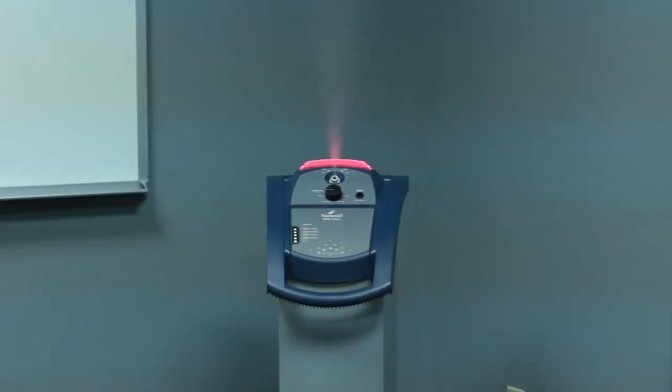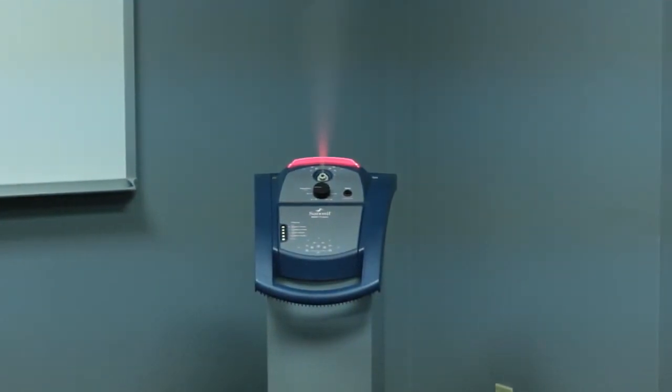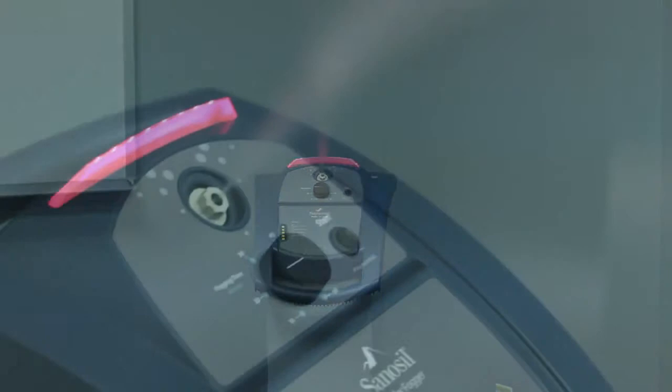The flashing red status indicator light will change to a steady red when the dispensing of atomized Sanosil begins. Make a note of the time the fogging process was started. The room cannot be reoccupied until the treatment process is complete, plus an additional 90 minutes.